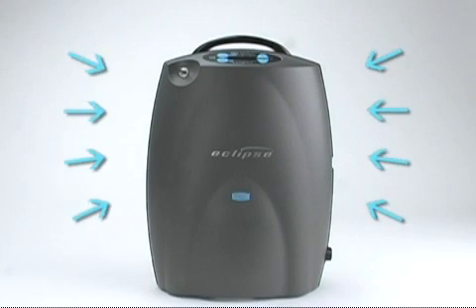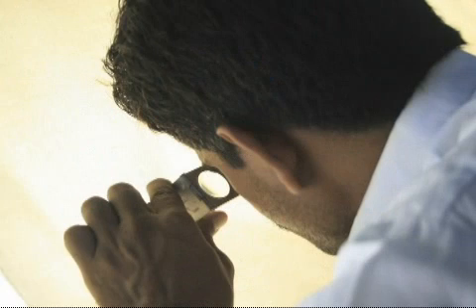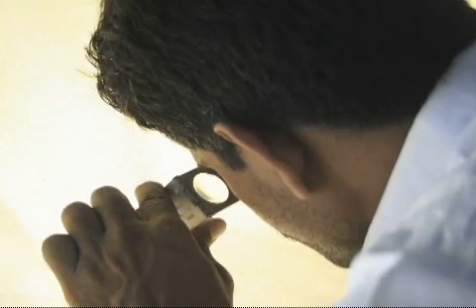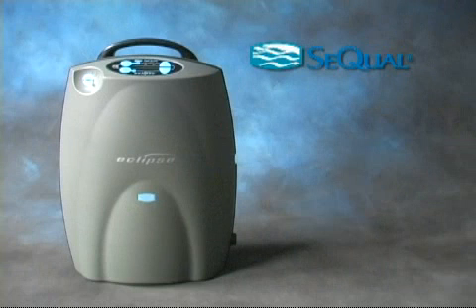The Eclipse II concentrates oxygen from ambient air using a sophisticated filtering system. To continue operating effectively, this filtering system will require periodic maintenance at an authorized service center. Your home care provider will manage the maintenance of your Eclipse II filtering system for you.